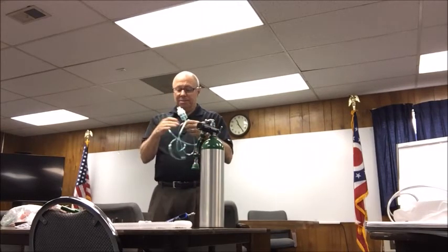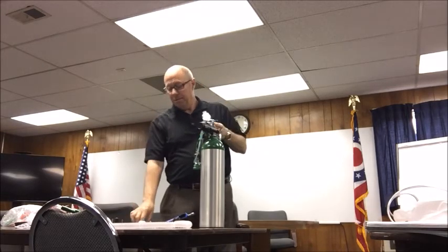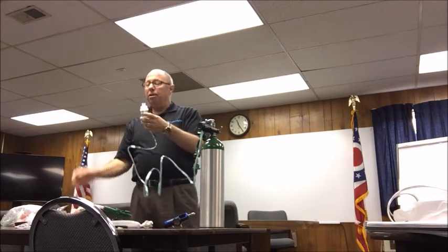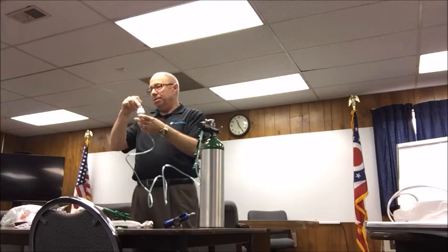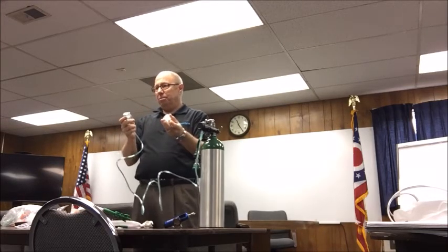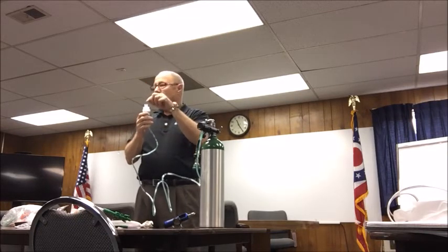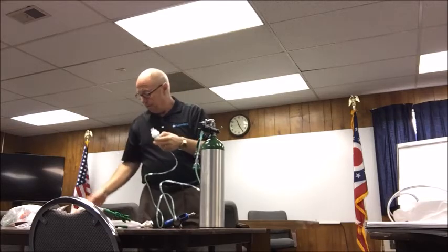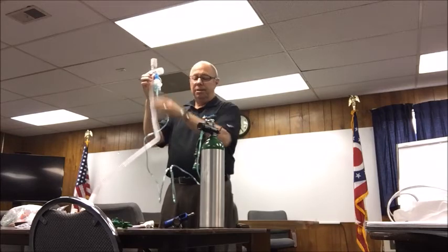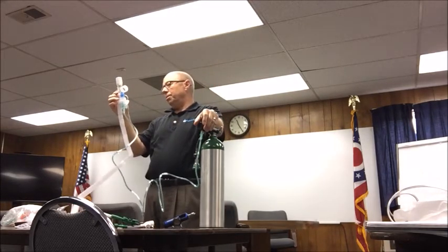So to nebulize, all you really have to do is hook it to the same regulator. I am a big believer in taking your medicine and dropping it in the top. Nothing ever good happens at 3 o'clock in the morning when I unscrew this thing. Things just go everywhere. Okay? Just drop the medication in the top. Insert it, give it a quarter turn, it locks it in. Turn my regulator to 6 or 8, deliver whatever your protocols are, and I'll nebulize.